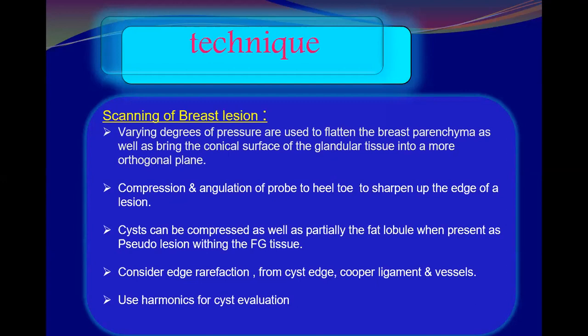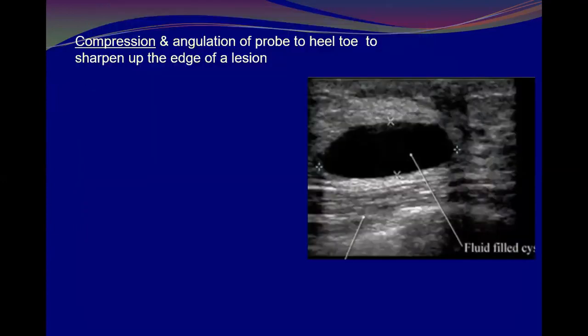And also we might add harmonics to evaluate the cyst, but not only for a cyst. We'll see later how compression is also helping us.